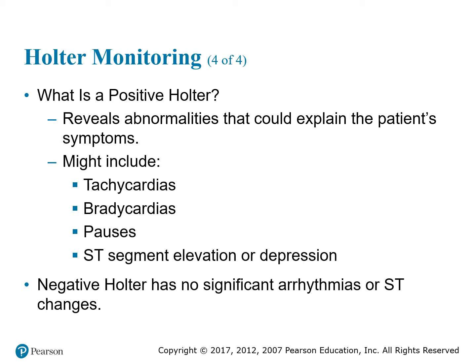Patients are allowed to sleep in any position that doesn't apply tension on the lead wires or electrodes, so they can sleep normally. They have to be mindful not to have any tension on the leads or the wires or the electrodes. The patient must avoid magnets, metal detectors, high voltage areas, and electric blankets.